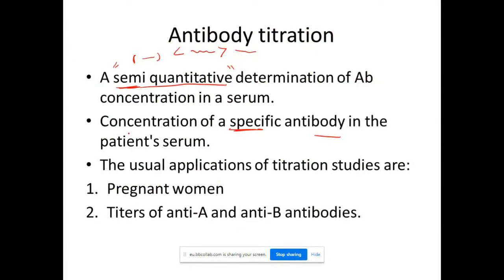Now, the clinical importance. Let's move to a different example. I have two patients: one has anti-K and gave me +1, and one has IgM anti-Lewis A, but it gave me +3. Is anti-K clinically significant more than anti-Lewis A, which is an IgM? Although this anti-K is +1 and this anti-Lewis is IgM +3, which one is more clinically significant, anti-K or anti-Lewis?